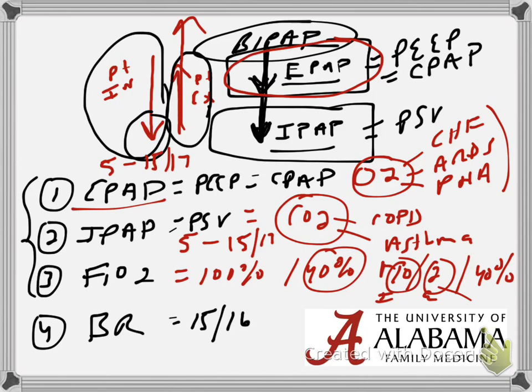All you have to remember is EPAP is about your O2, IPAP is about your ventilation and CO2. So that is BiPAP in a nutshell.